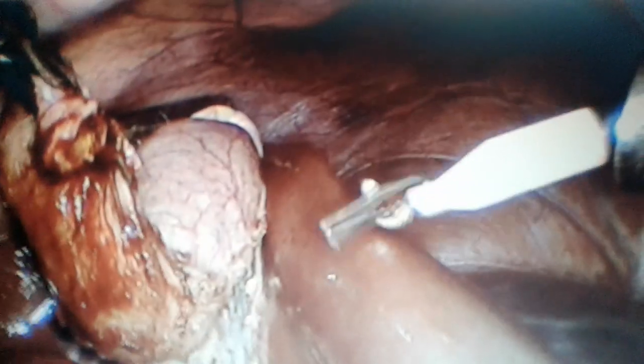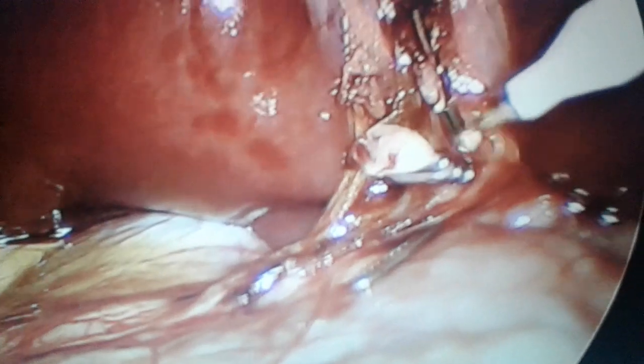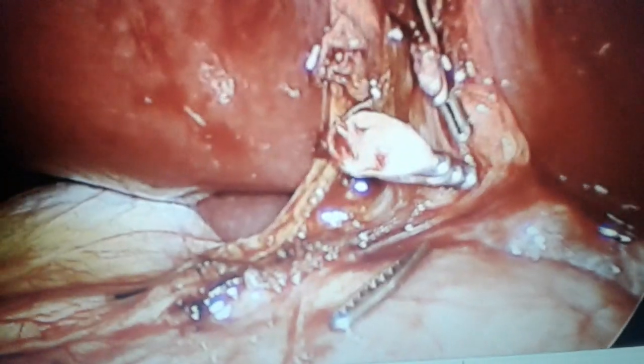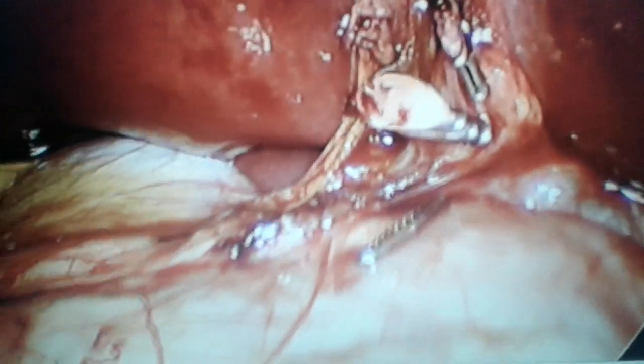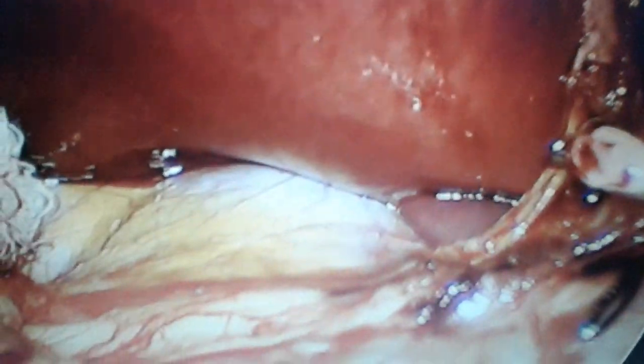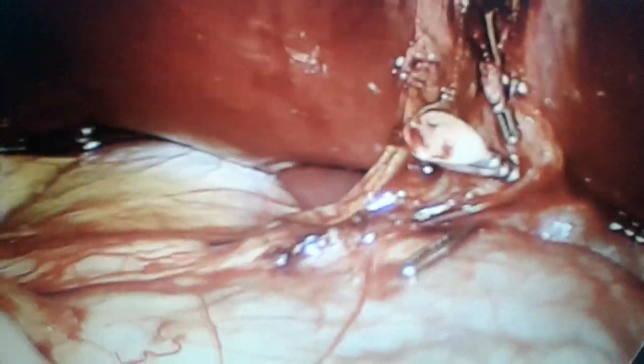Okay, let's see what has been done in this surgery. Okay, always the first important rule is to always have an eye over any foreign body that is lying inside the peritoneal cavity, like this Liger clip, or what is the other foreign body that is lying inside this peritoneal cavity?